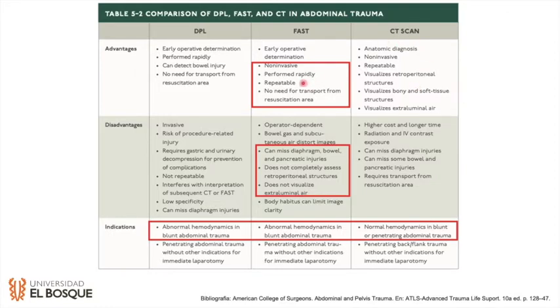Also, it is repeatable, so you can repeat the exam if you are not sure, for example, if the patient has intraperitoneal fluid or maybe you missed something.